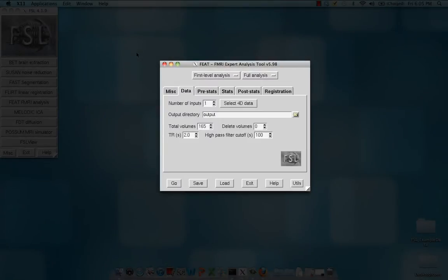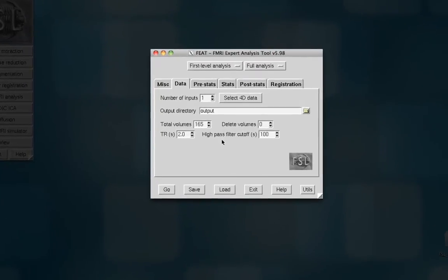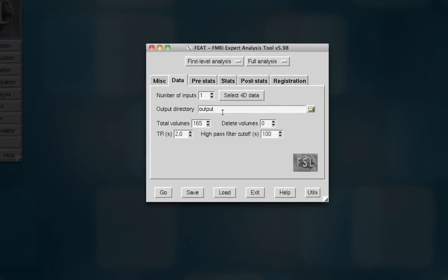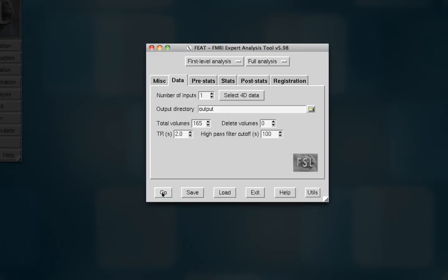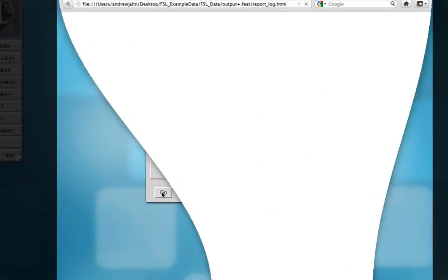Now that we've finished entering everything into FEAT and we've set up our model, all we need to do is hit go. One thing I should mention is you should type in or select an output directory. In this case, I've just typed in output. This is under the data tab. So any analyses will be output into this folder that you specify here with a .feat extension. Okay, so everything looks good, and we can go ahead and hit go.